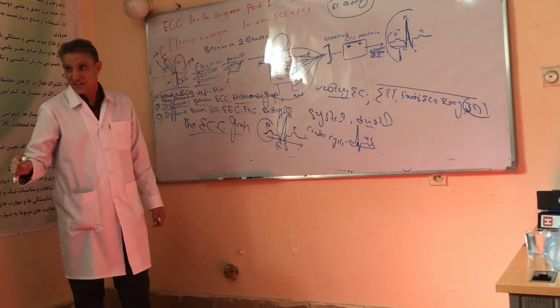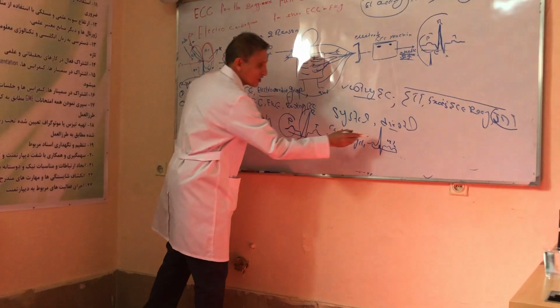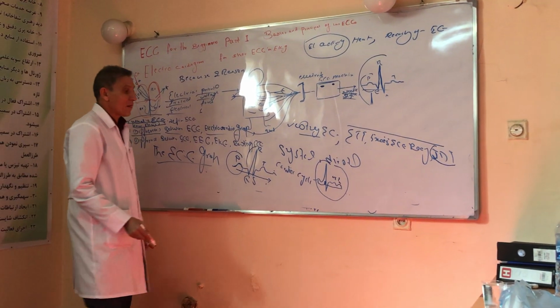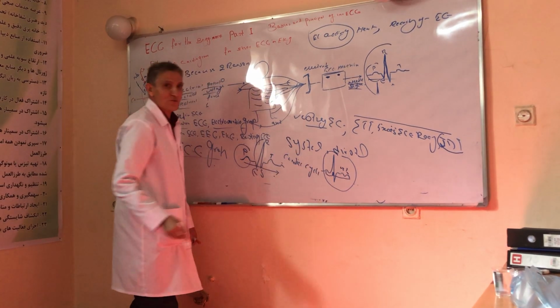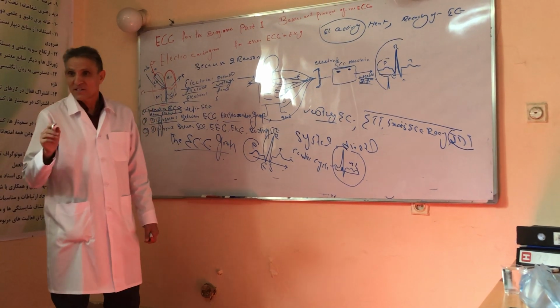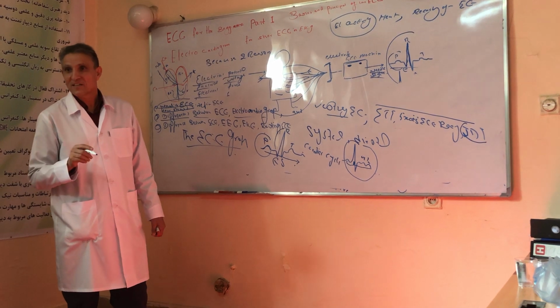ECG to mechanical events. We have discussed this in our future lecture. This represents one cardiac cycle, which is made from systole and diastole. Remember, we should not forget, for systole and diastole, we also use some other electromechanical terms. When we are taking the name of these electromechanical terms, it also represents systole.